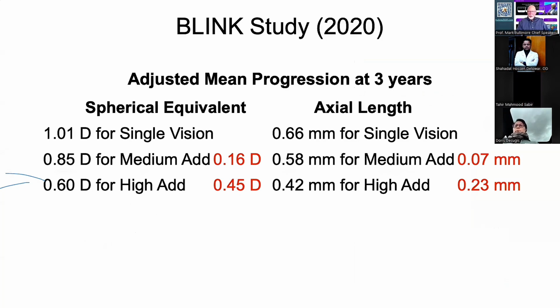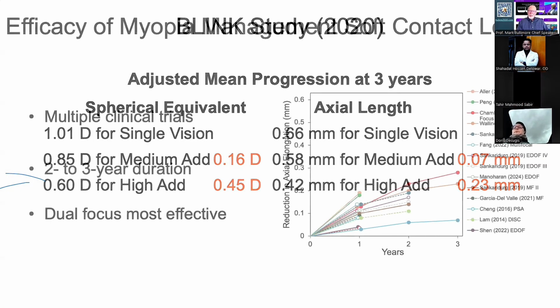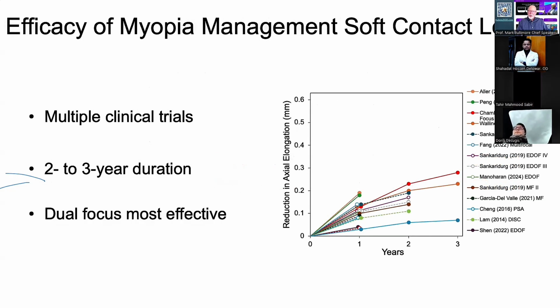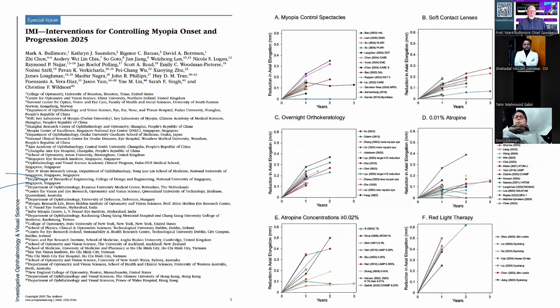So if you're going to use a center distance multifocal, then obviously go for the high add. And again, these are data from both those two studies. You can see the red and the orange lines at the top are from the two studies I presented, and the blue line at the bottom is for the medium power add. Those are the only studies with 3 years of data in a randomized clinical trial. But you can see a range of efficacy. So again, I encourage you to go back and take a look at these data here.